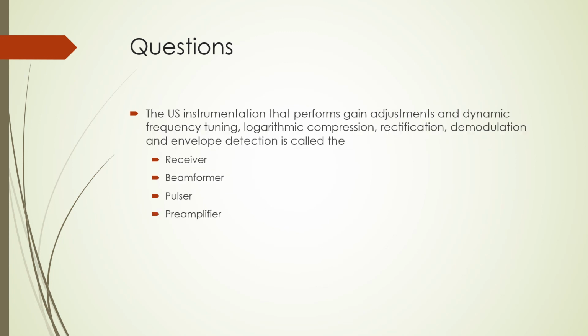The last question is shown here. The ultrasound instrumentation that performs gain adjustments and dynamic frequency tuning, logarithmic compression, rectification, demodulation, and envelope detection is called what? And I'll give you a few seconds before we go on.